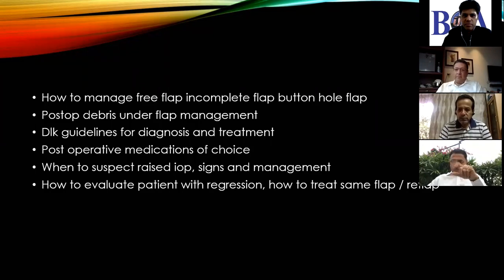Himanshu, you were saying something? Yeah, actually, every time suction starts and your Moria or whichever goes, you've got to take God's name. By the time you react, midway suction loss is the worst thing, even with a femtosecond. You've seen multiple videos, each one of us says that in those 30 seconds, nothing happens. And it's a deadly scenario. You can't do anything. It's all very nice and dandy to say I can do this, I can do that, till your action has started. Once it has started and the bullet is out of the barrel, it's very difficult to control after that. So it depends on what time you lost your suction. And be very careful with suction, take your time. And as Burjot said, do the other eye and come back to this eye.